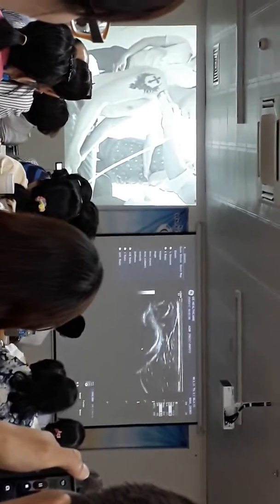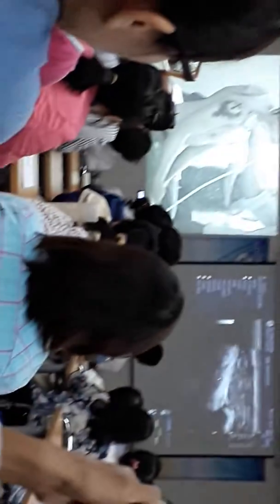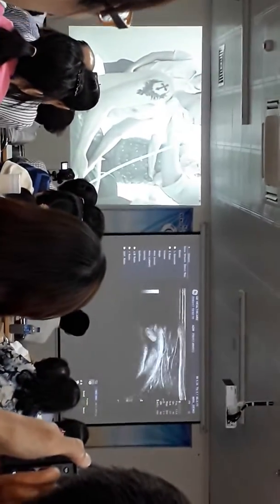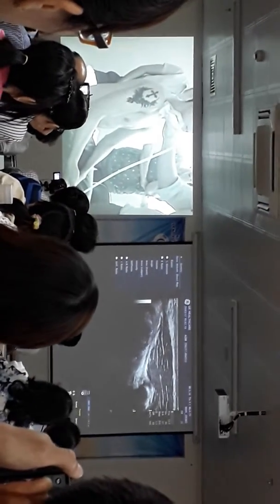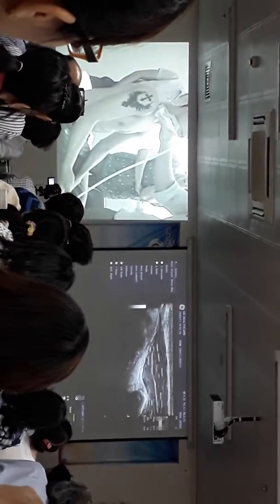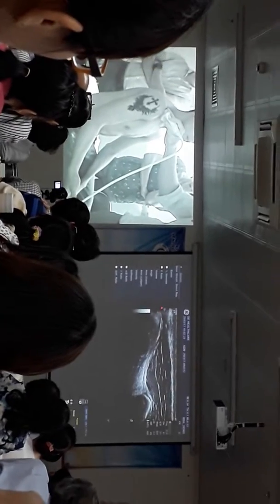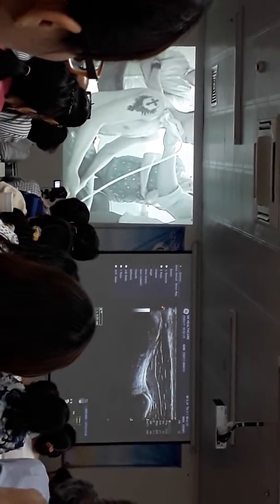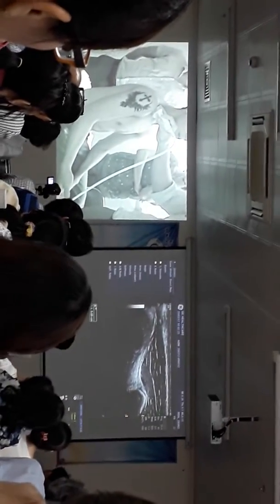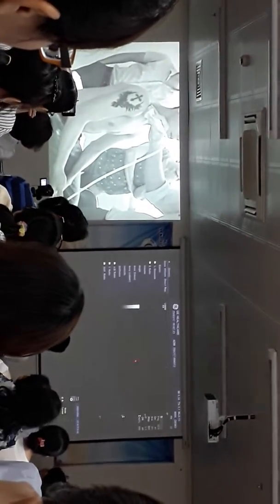From there, I come back up and I have a quick look at the CA ligament. Bây giờ mình sẽ kiểm tra nhanh về cái khớp vùng đòn, which goes from the acromion to the coracoid. So we've got acromion over here, coracoid process here. Đây là dây chằng quạ đòn, đây là mỏ quạ, đây là mỏm cùng vai. Dây chằng nó nối giữa mỏm cùng với mỏm quạ, dây chằng quạ cùng. And this thin structure here is the ligament. Đây là cái cấu trúc mà đo nè, là bề dày của dây chằng quạ cùng.